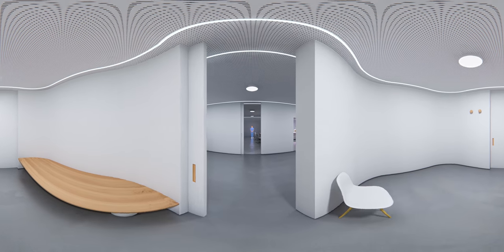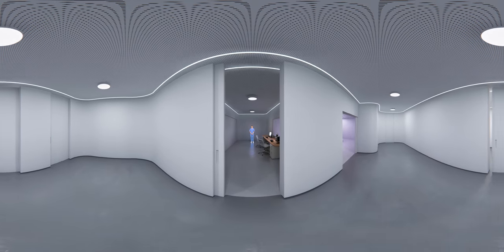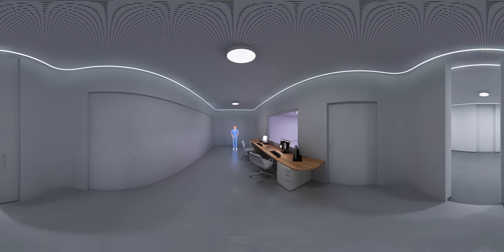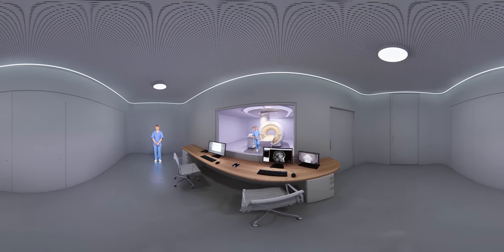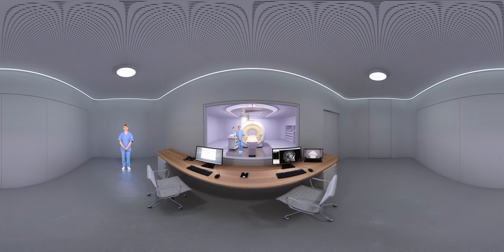Let's take a look at the operator room. While you're in the scanner, this is what the operators see. The middle screen shows the images that are being made. Using the right screen, the operators can keep an eye on you throughout your examination.